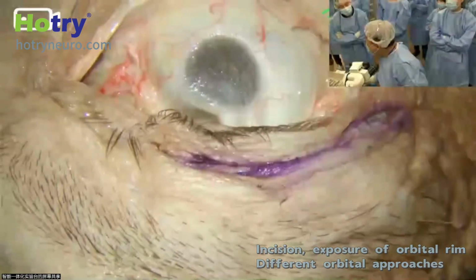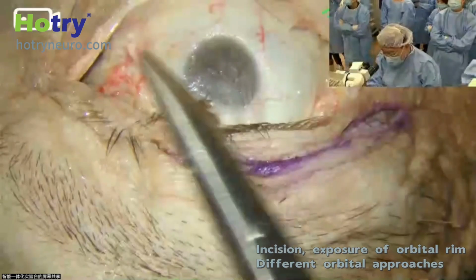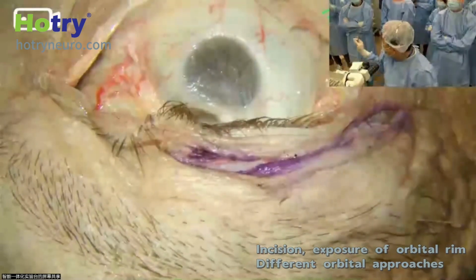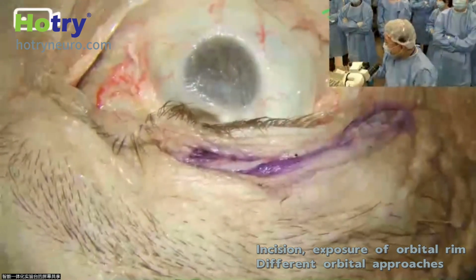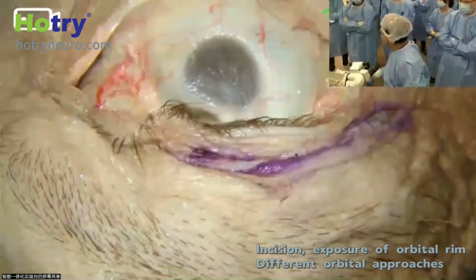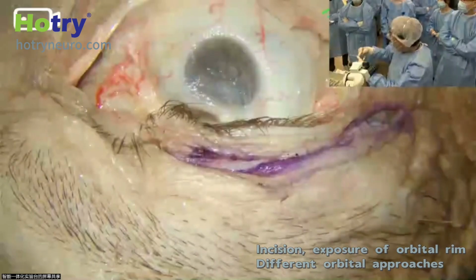Pardon me? What sutures do we use? If this is a transcaruncular incision, just 6-0 sutures, very easy. For the transconjunctival incision, the beauty is that actually you don't need to close it. But I personally like to approximate the superficial conjunctiva.